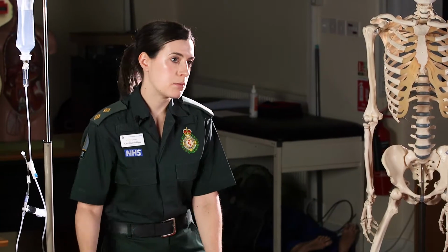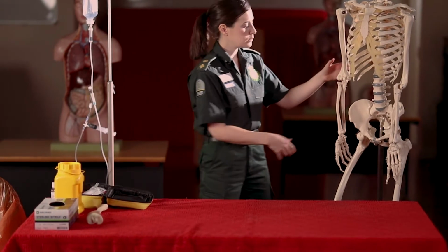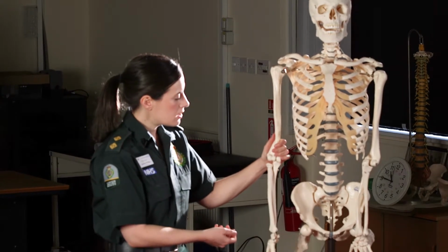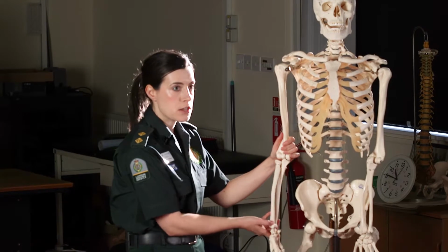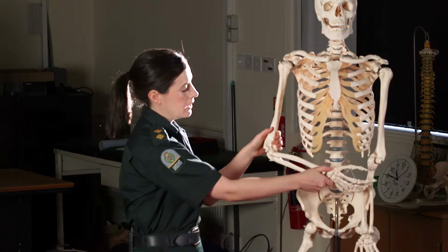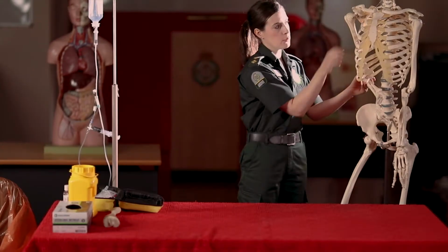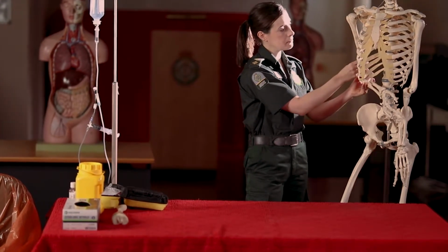Now I want to locate my site. So when measuring the sites, the first option we have is the proximal humerus. In order to find the site here, it's very important that I adduct the arm. So I'm going to put the hand on the patient's belly button and tuck the elbow in, and that will allow the humeral bone to become prominent. And you might need a crewmate to assist you with this.